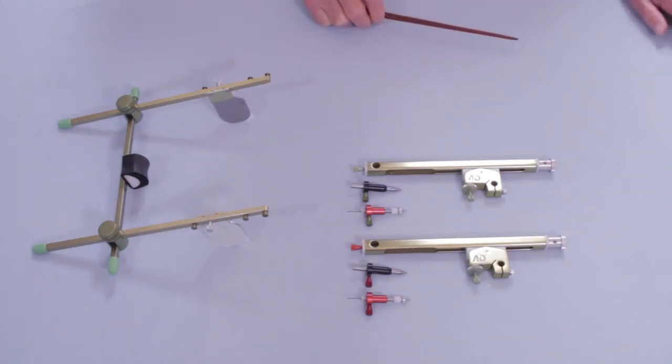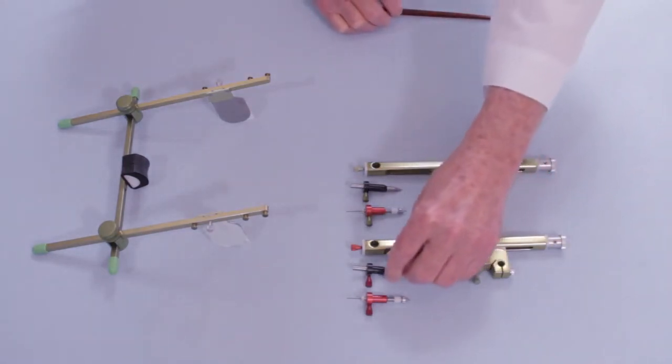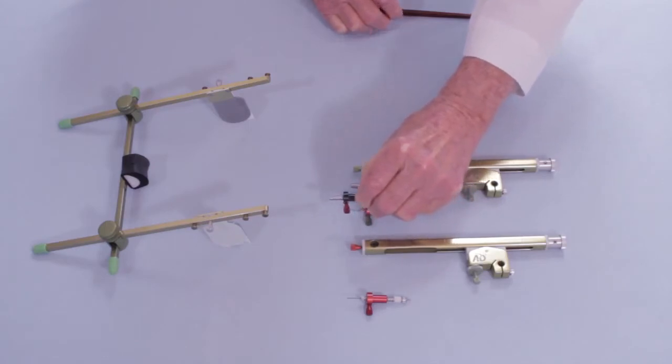And one of the things that's extremely important is that the sidearm distance from the flag be set correctly so that the writing pencil will work correctly. And I would like to show you how that is done. I'm going to use the stylus pen from the right side. We know that it's from the right because the red matches the right on the red on the sidearm.